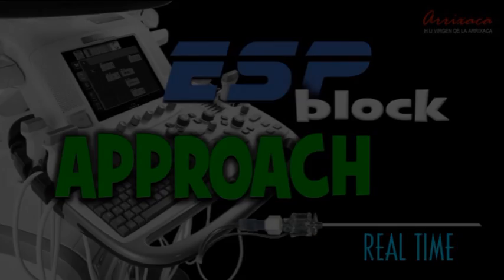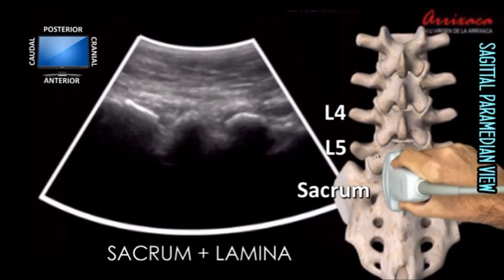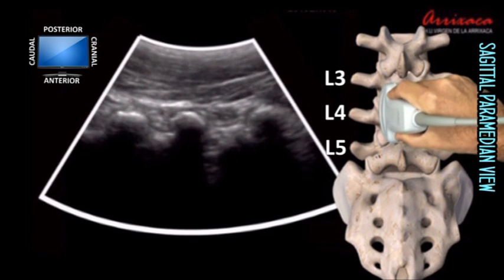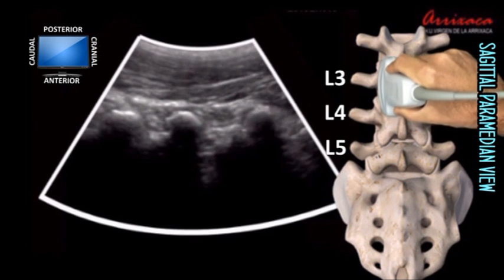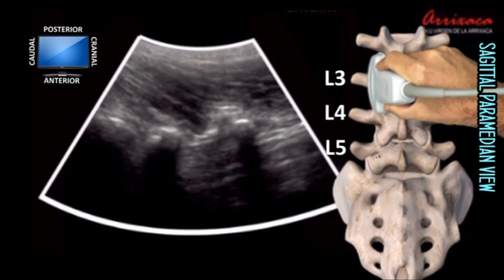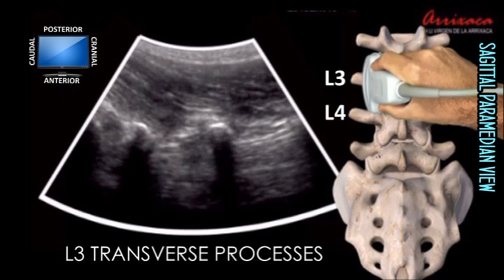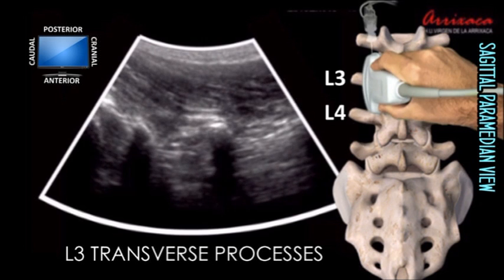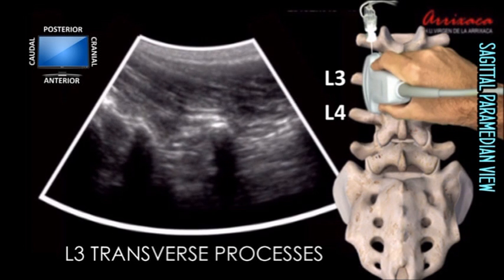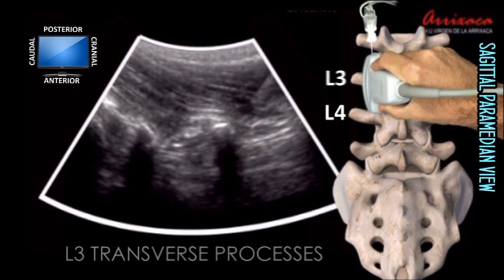The curvilinear probe is placed in a sagittal orientation over the sacrum and slid cephalad to identify the sawtooth-like continuous hyperechoic line formed by the articular processes at the lumbar level. Once the laminae have been identified over L3 or L4, the probe is moved laterally to identify the transverse processes.